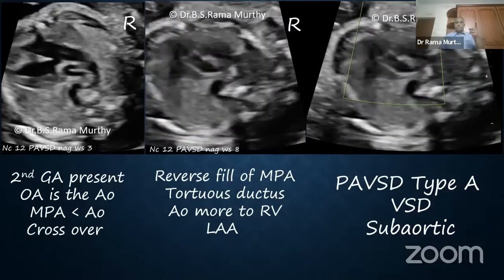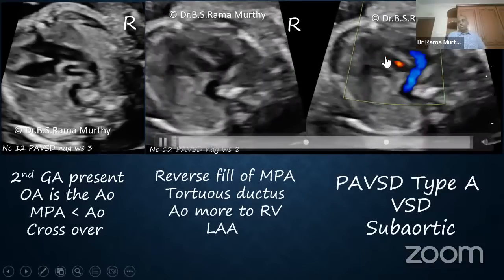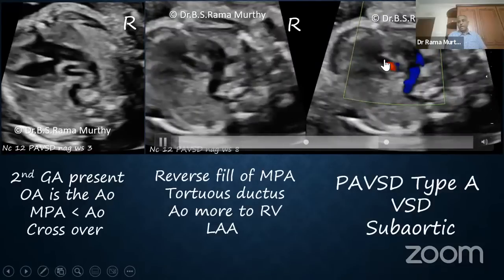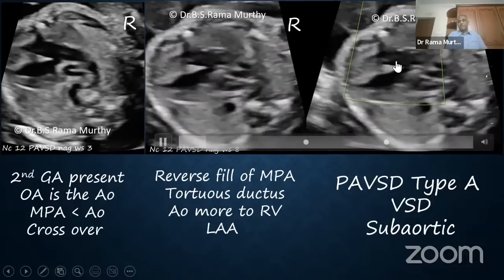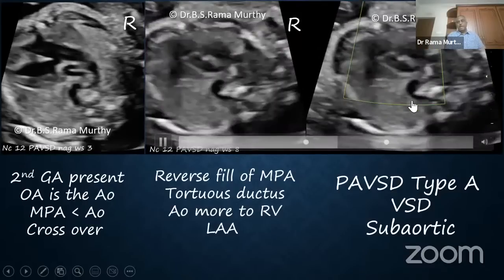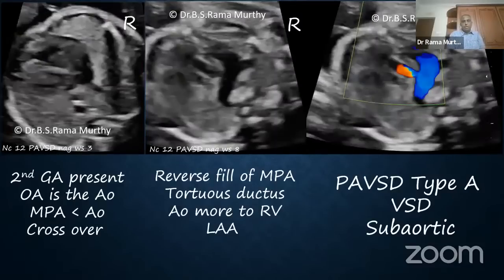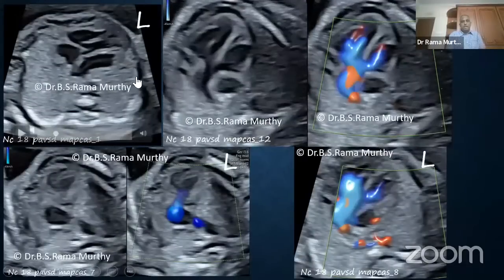I will think of colors, isn't it? But when I turn the color on, you find that instead of the pulmonary artery coming in blue, antegrade flow, it is coming in red, which means retrograde flow. That immediately tells me that the pulmonary valve here is atretic. So therefore, this is pulmonary atresia associated with a VSD. So it's PAVSD, ductus dependent type of pulmonary circulation, and it is called type A, right? Yes.